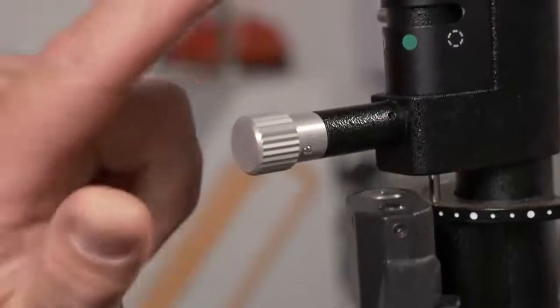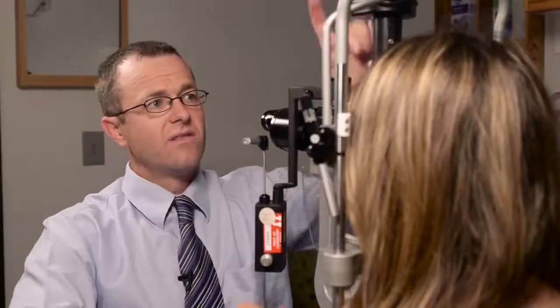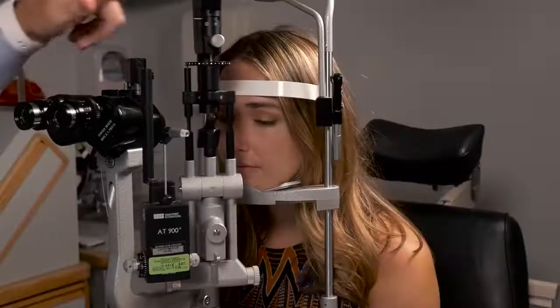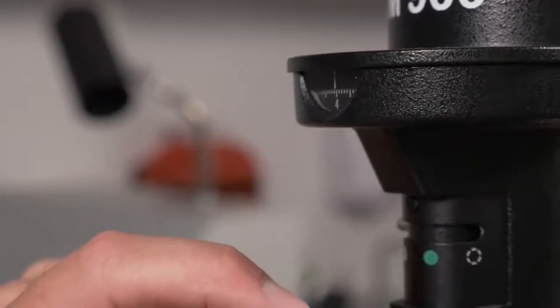Also at the top here, it gives a size of the beam. So this increases the width, this increases the height. The knob that's up here at the top increases the height of the beam. On the slit lamp itself, it actually gives a millimeter measurement.